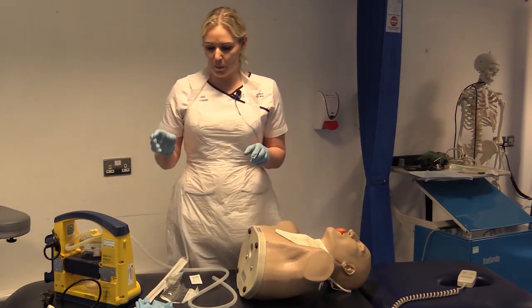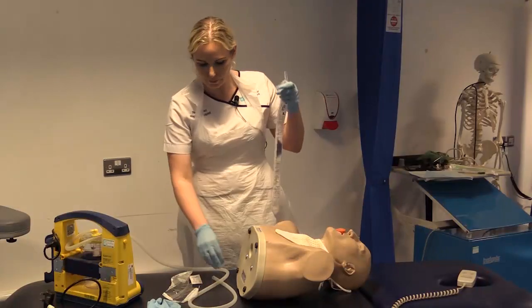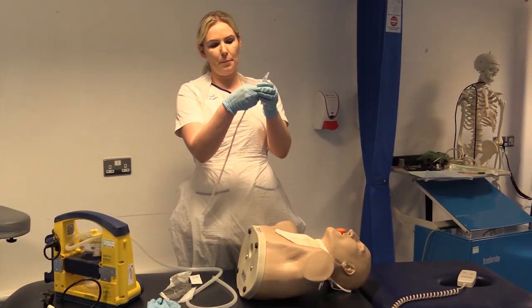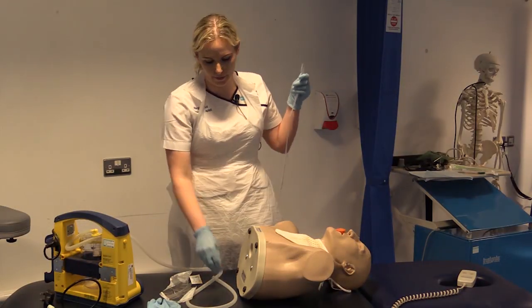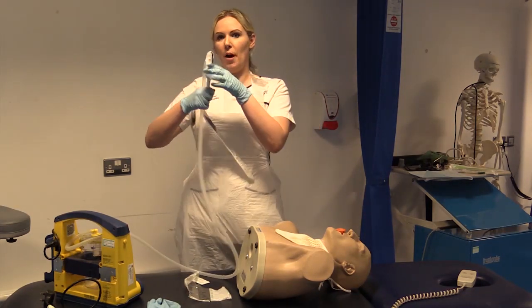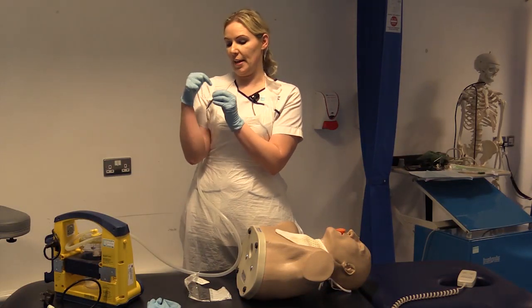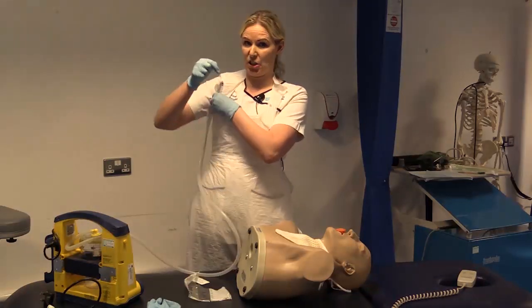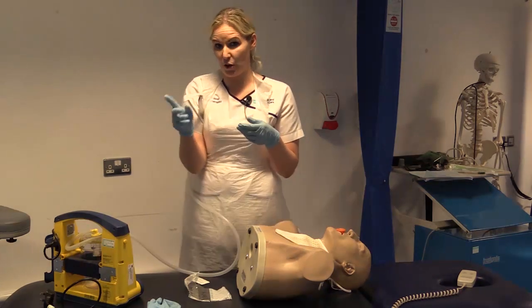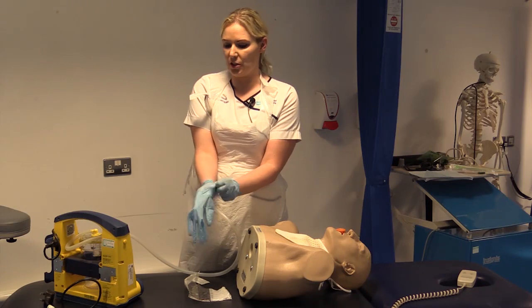Now we're going to choose our appropriate sized airway, and we're going to attach it into our suction tubing, just by opening again at the top, keeping the rest of the catheter in the plastic sleeve. We're going to insert into our suction tubing. We're going to pop that in under our arm. Again, you can apply another thin layer of gel on the inside of your plastic sleeve just to aid insertion of the catheter. At this point we're going to add our second glove, and this is going to be our clean hand and the only hand that touches the catheter.